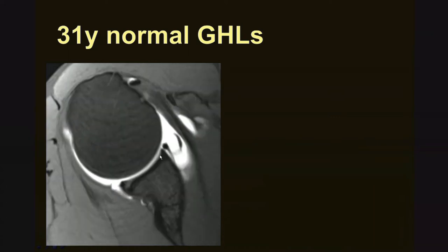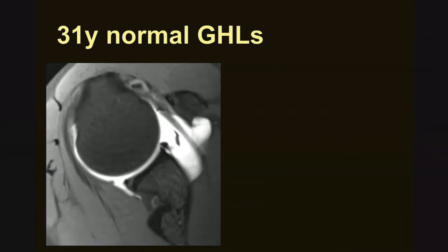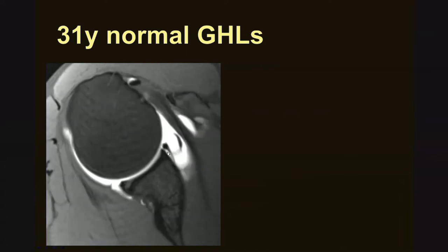In the anterosuperior location, the labrum shows developmental variations that can include sulci or a foramen. In this particular case, the labrum is completely undercut by contrast material. This is an arthrographic study, and all this white material represents contrast injected into the joint. In this location, this is not representative of a labral tear. Instead, this is a normal developmental variation — a sublabral sulcus or foramen.